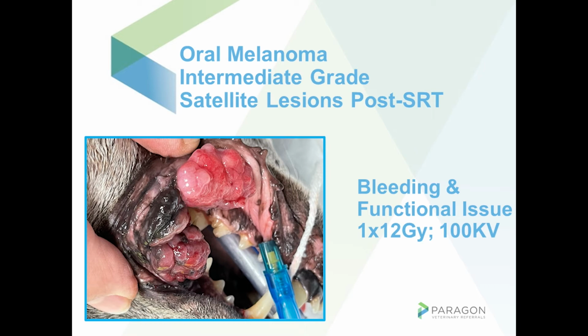It's a very high dose, so we've got to be very careful what we treat with that. With 100 kV, which is going to give us at least a centimeter depth. So I essentially placed all these tumors inside of a cone, and you're actually able to manipulate the dose based on the fact that there's tumor inside the cone. You can also adjust if the tumor is outside of the cone and not just at the same level. And so I was off all other structures.